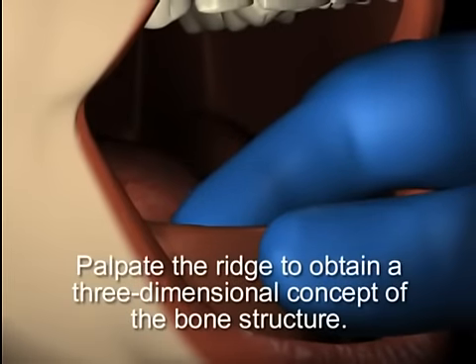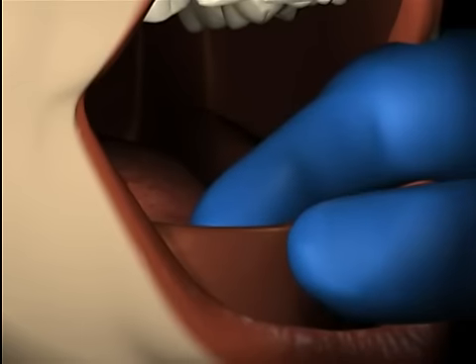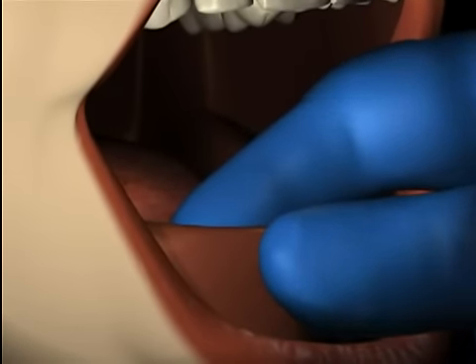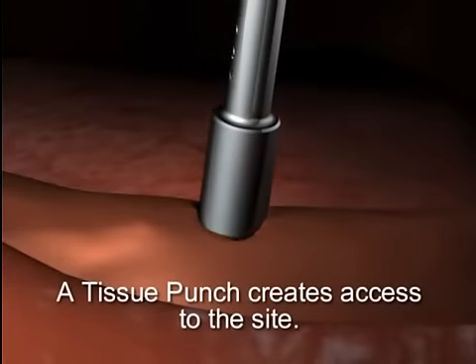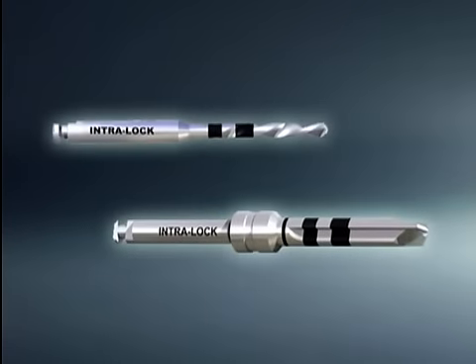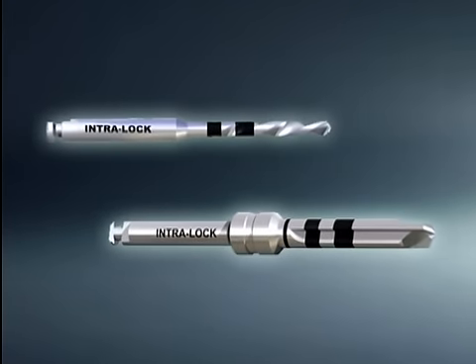Palpate the ridge to obtain a three-dimensional concept of the bone structure. Ridge calipers and the use of a dental probe can be employed to determine the location and depth of the surgical sites. A tissue punch may be used to create access to the site. A full-thickness mucoperiosteal flap may be employed if indicated. A constant external flow of sterile irrigation should be applied during the drilling stages.